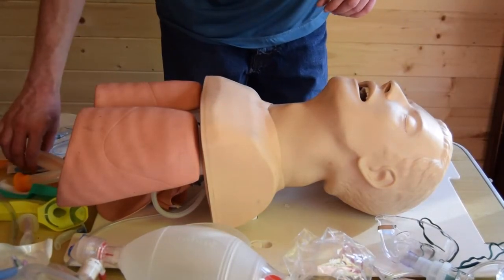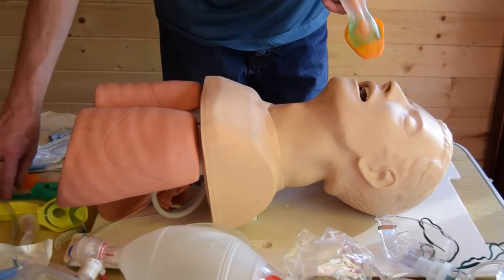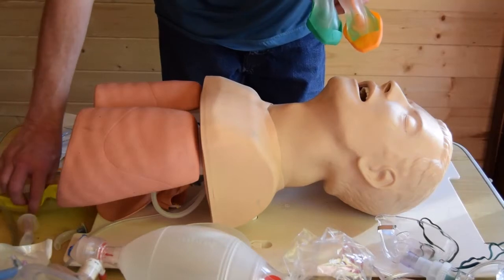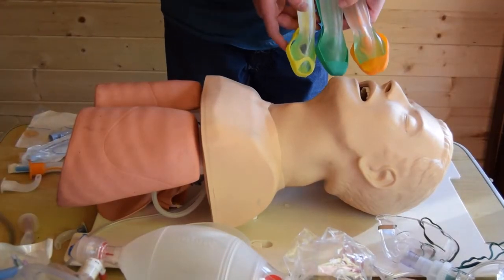The third sort of airway we're going to look at today is your i-gels. Again, these come in different sizes. I have 3 sizes here, and they're based upon weight.